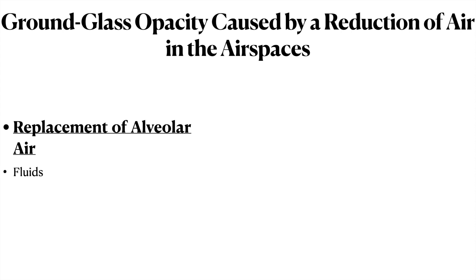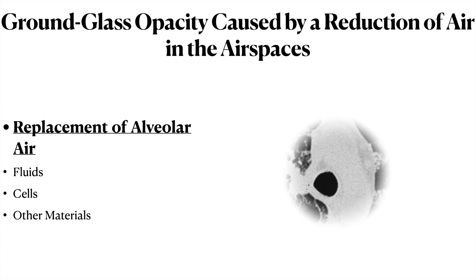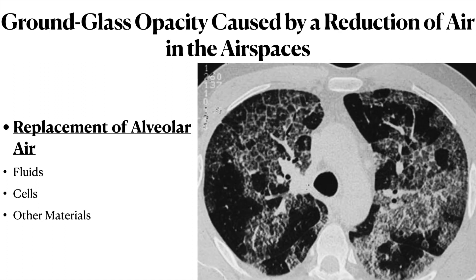Next is replacement of alveolar air, which is more common. The air can be replaced with fluids as in pulmonary edema, or cells as in infections, or other materials such as in alveolar proteinosis. Here you can see diffuse infiltrations throughout the lungs bilaterally, and since the vessels are still visible this is ground glassing. You can also find thickening of the interlobular septa.